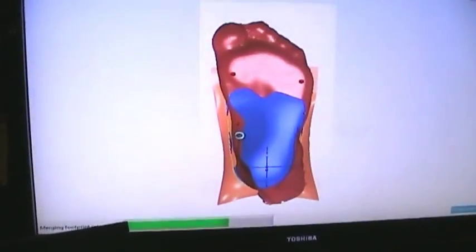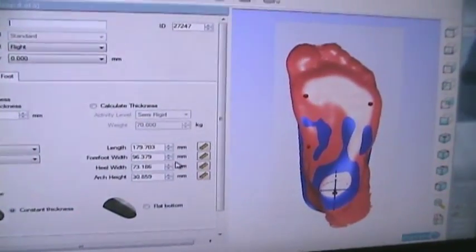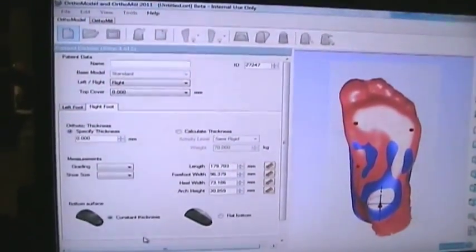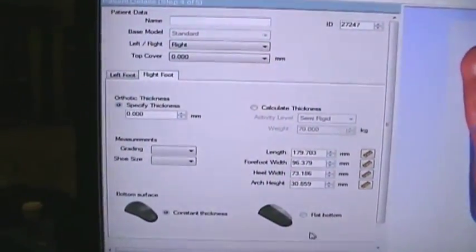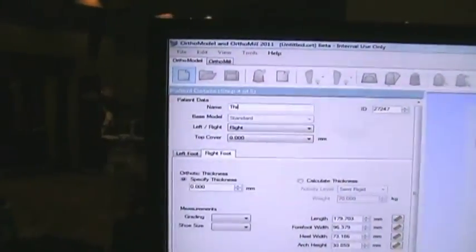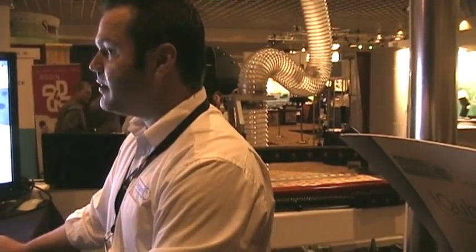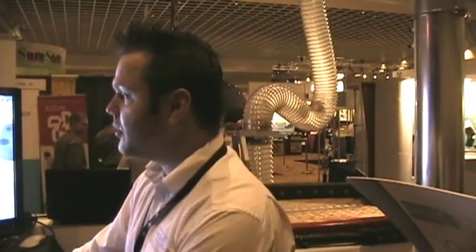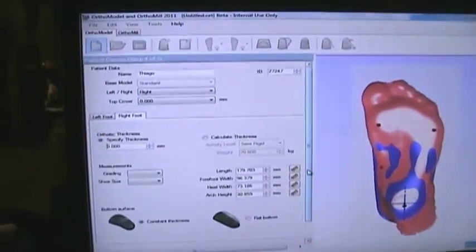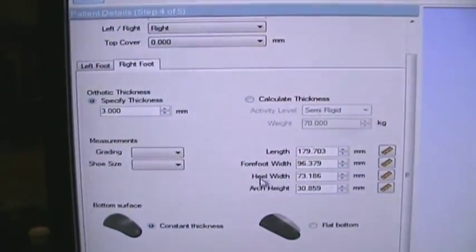For this process, are we building a hard plastic arch support or an EVA arch support? We are building a hard plastic arch support, but we can also create an EVA orthotic — either a constant thickness orthotic or a flat bottom orthotic. Before that, I'm going to enter the patient's detail information such as the name, ID, and orthotic type. I'll also enter the thickness of the orthotic. The software has measured the entire foot to design the orthotic based on the foot shape, including length, heel width, arch height, and forefoot width.